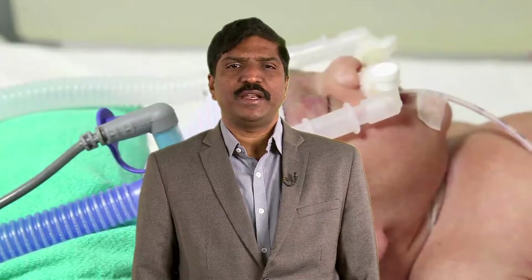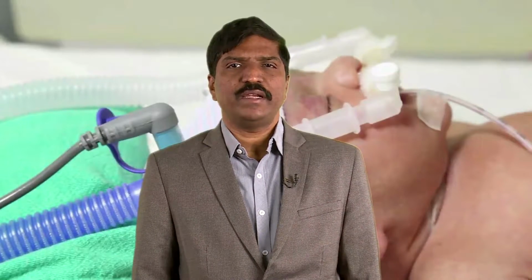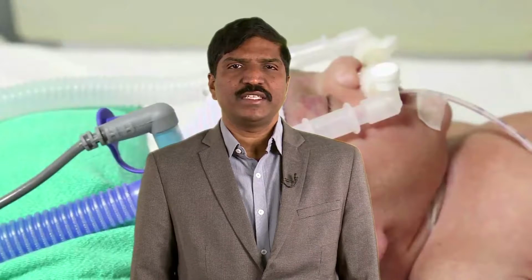Respiratory monitoring should include assessment of respiratory rate, recessions, chest movements, breath sounds and bubble sounds. An objective assessment of Silverman-Anderson score is very essential, at least in each shift.